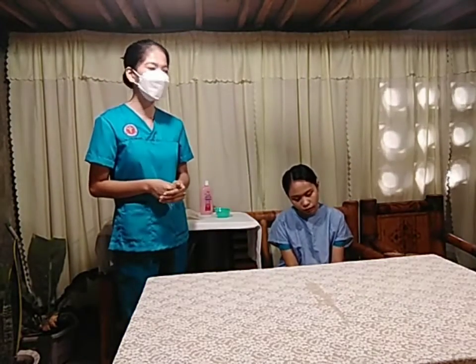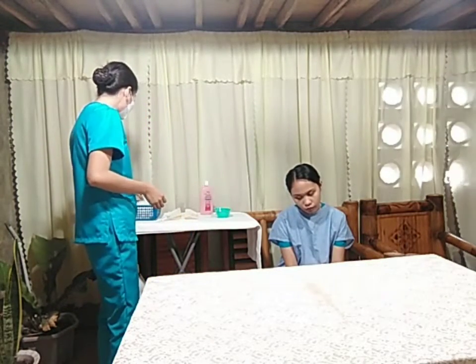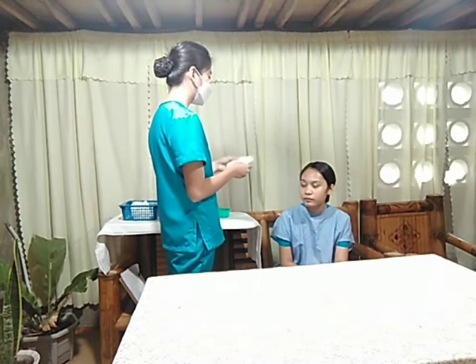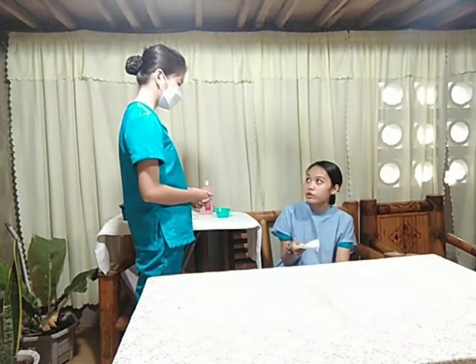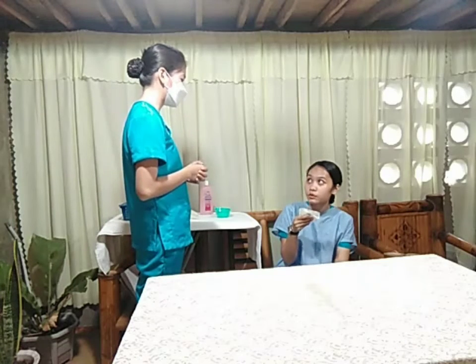So I have to explain that to the patient. Okay. So ma'am, karon ma'am alayon kog sigma ma'am, pero hinay-hinay ra ma'am. Okay. Clear ma'am. Both nostrils.